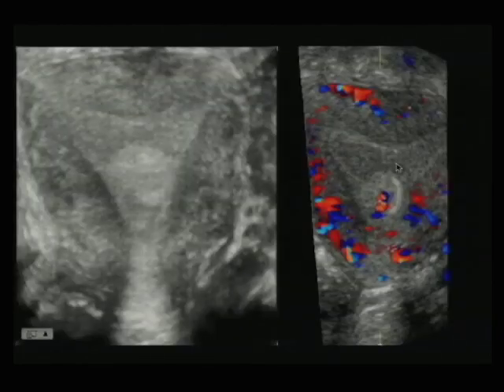You can also turn on the color. After all, 3D ultrasound is 2D ultrasound. It's just a whole volume of it. So you can use the same techniques, and here we're turning on the color on this fibroid, and what do we have? A small feeding vessel right here that indicates that there is blood going to that polyp.